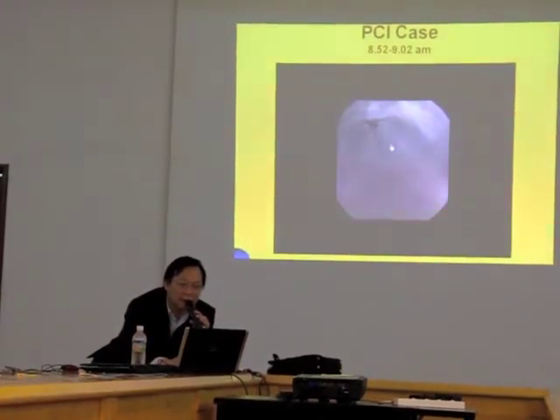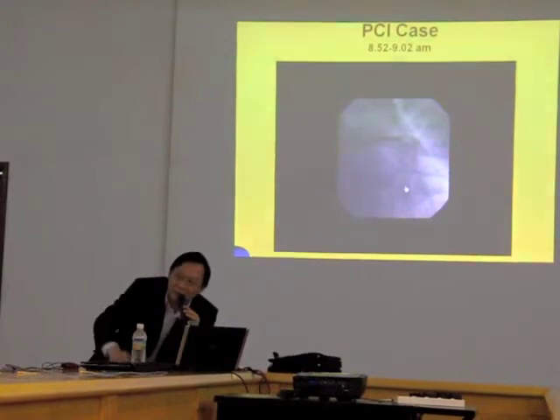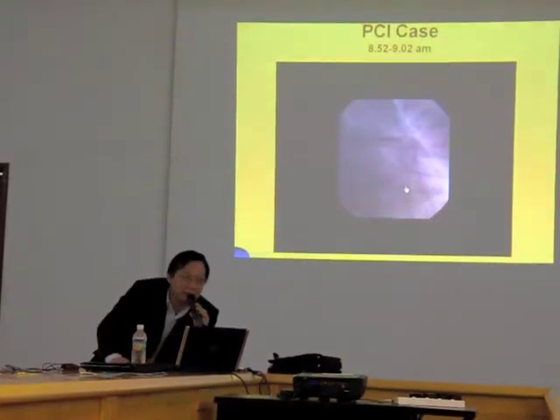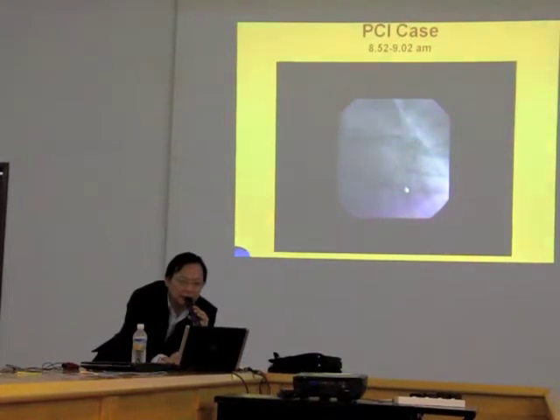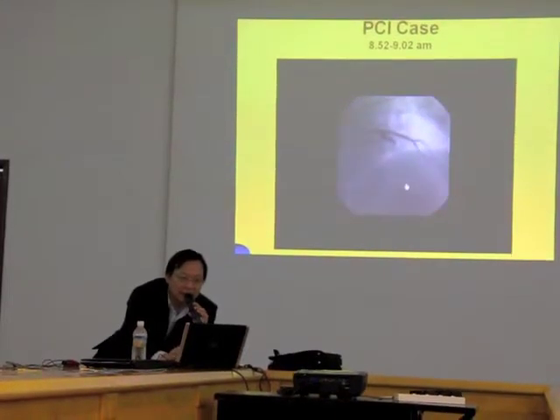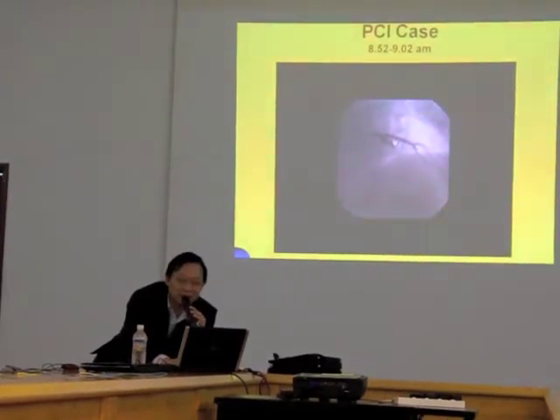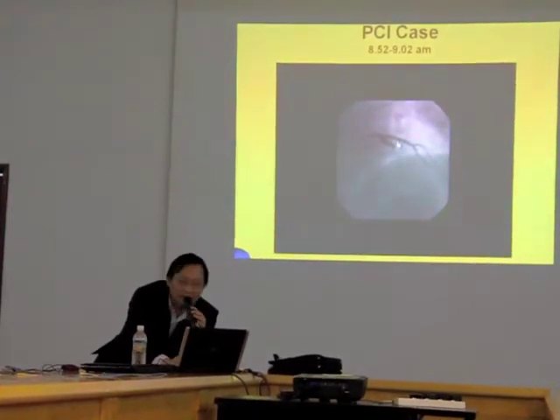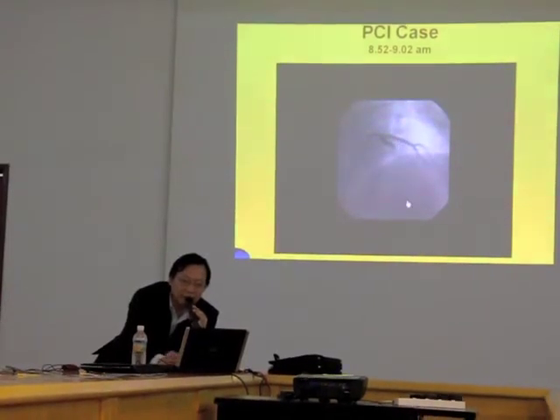There you go — the stent is here. Now I inflate the stent by inflating the balloon so the stent will also be inflated. Once the stent is inflated, I take the balloon out, then do an injection.